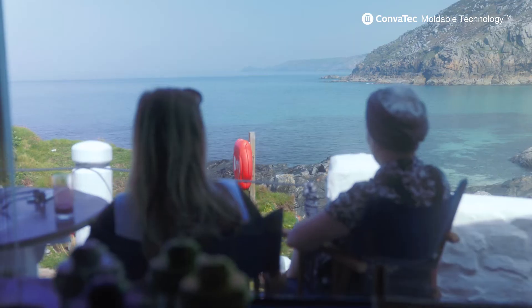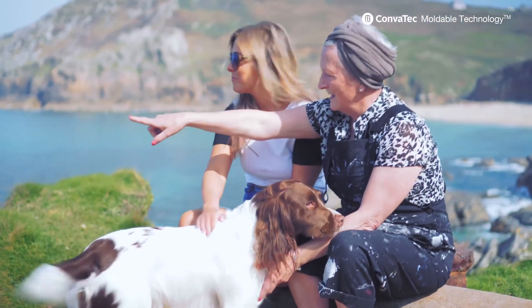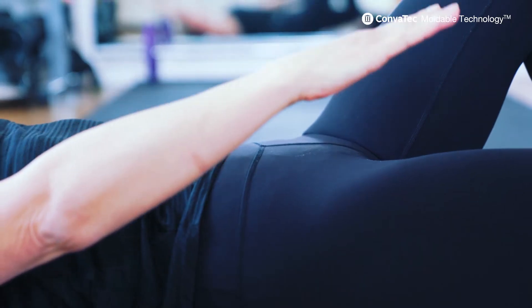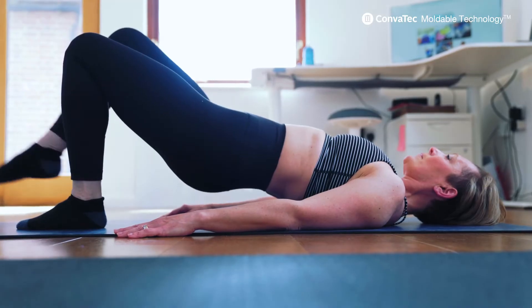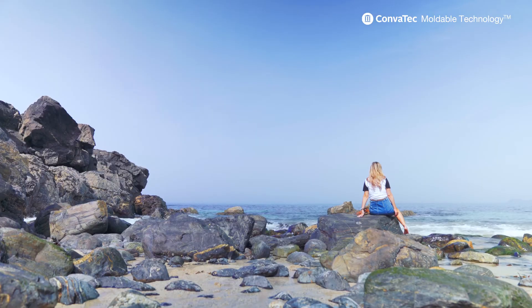I can't even put into words how I felt before I discovered Mouldable. I thought, why have I not been using this for years? Because it genuinely has changed my life. I sometimes just forget that it's even there. I wouldn't go back to using a cut bag now because it's just so much easier. You can wear anything you like, no one can even tell you're wearing a stoma bag. I don't even feel like I have it. I'm just really grateful that Convatec Mouldable technology exists.